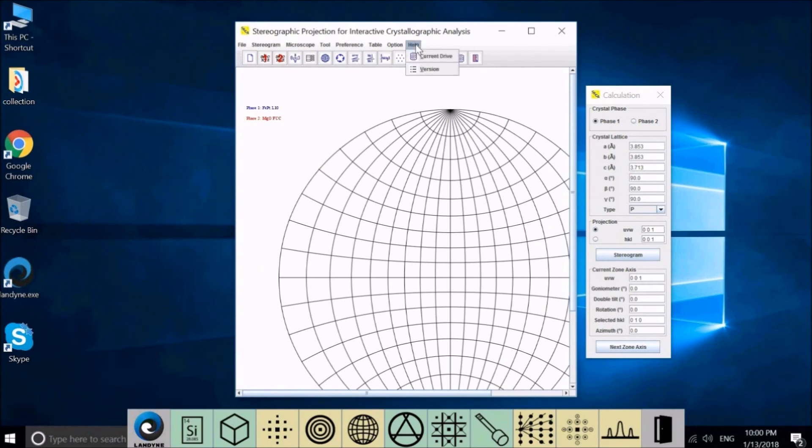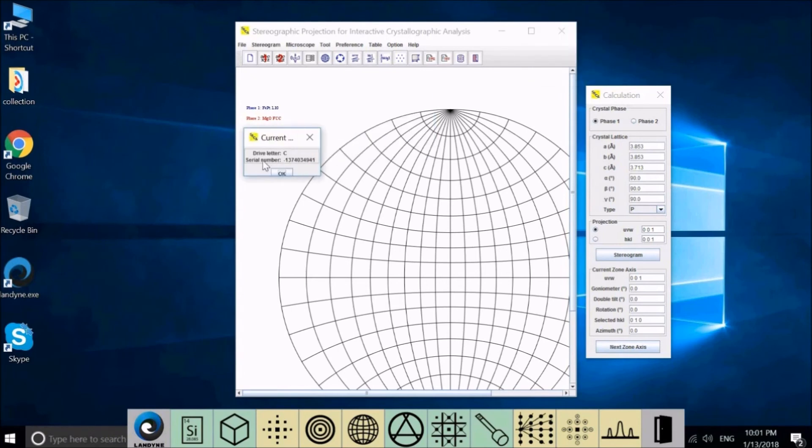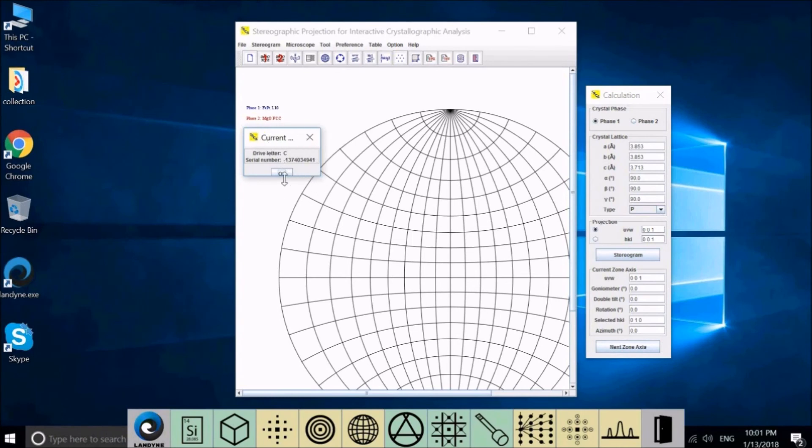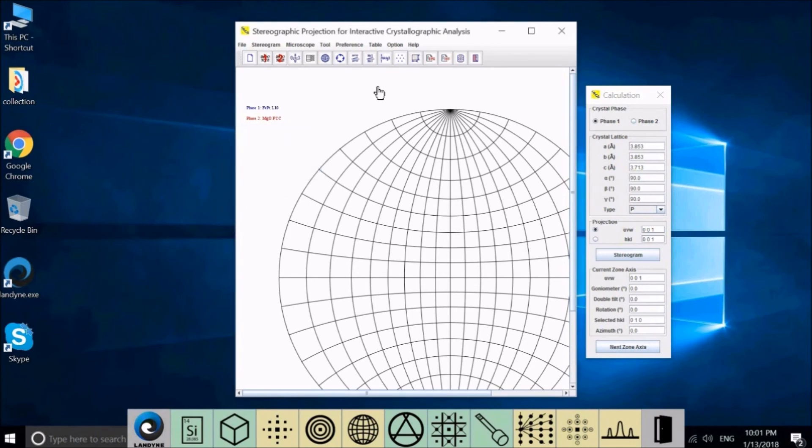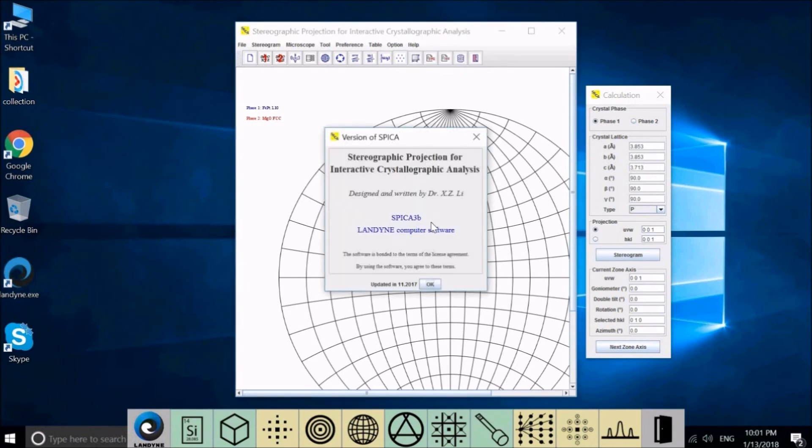In Help, we have the current drive and serial number. You can read out your serial number. You can copy this number to us or just take a snapshot of the dialog window and send to us, so we can prepare the license file for you. The last one is Version. It tells you which version the program is and what is the last update.